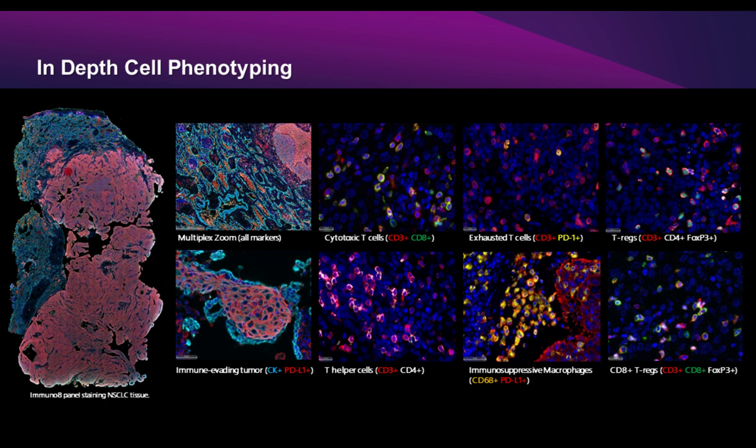And then you have to look at your on-prem equipment to make sure it balances out and spec that out properly. That process just to get set up is pretty time consuming. In our experience, we were routinely 6 or 8 months to get a 4-plex panel IF into production, and it was a significant amount of effort on our team.